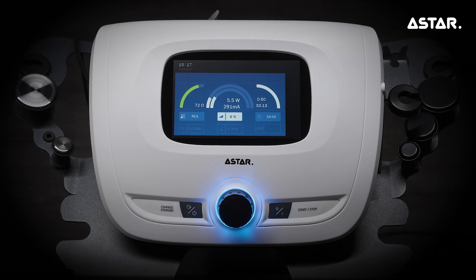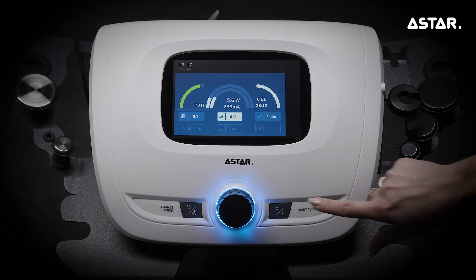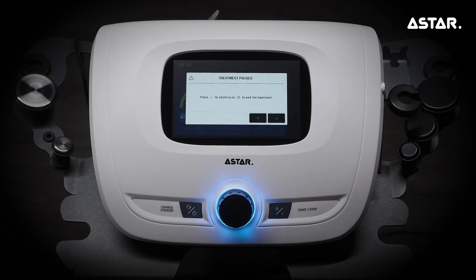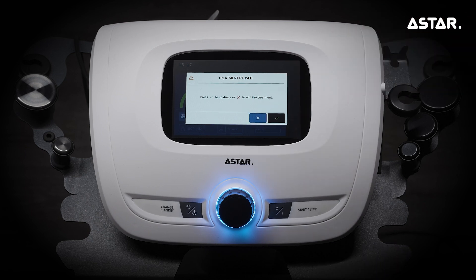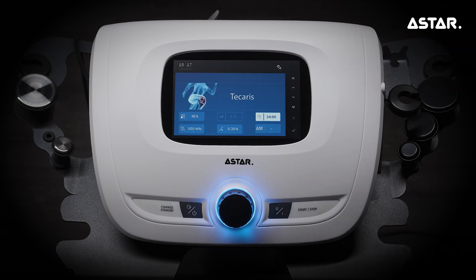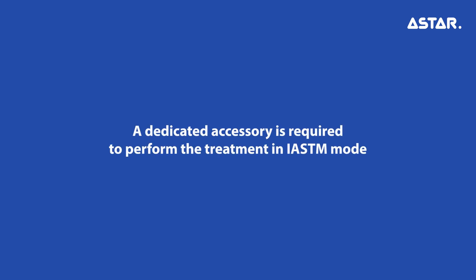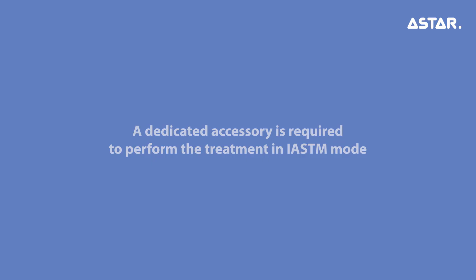Press the START-STOP key to pause the treatment. Press X to return to the main menu. A dedicated accessory is required to perform the treatment in IASTM mode.